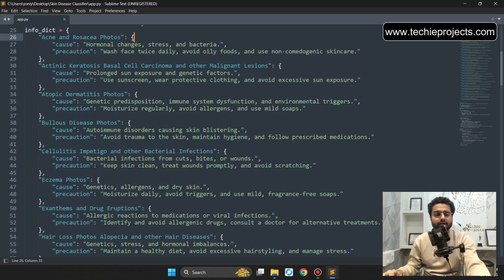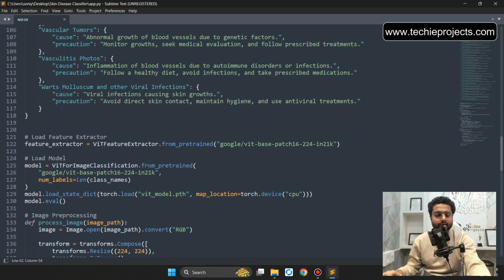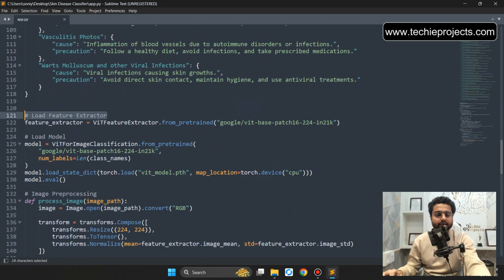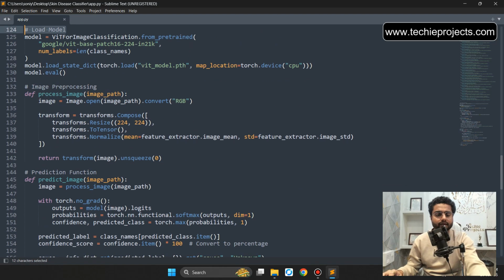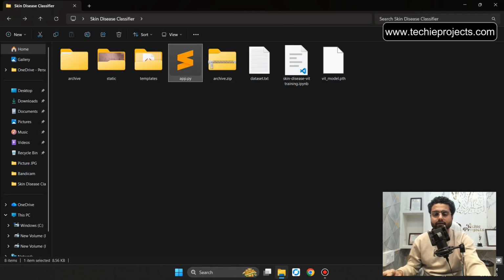So it will give the detailed description about disease like acne and rosacea photos. So that will be the particular cause and the precaution. Load feature extractor, load the model, and image processing, process the image and predict the image. Okay, Flask routes. So let's close.